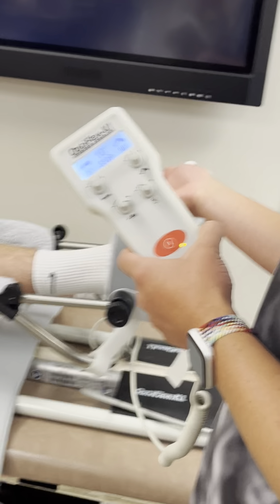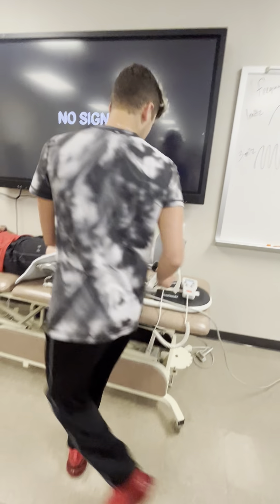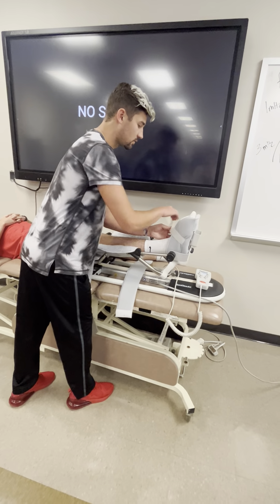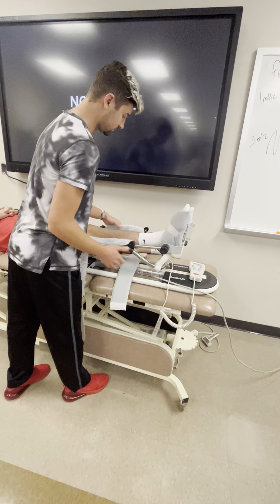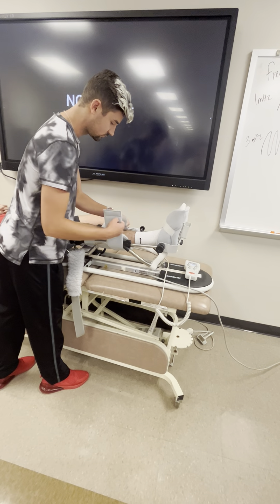So I would take his leg out, have it run through it, make sure it looks okay. So now I'm gonna strap them in. That's why I brought the top of the phone, to kind of help me figure it out. Yeah, that will correct.